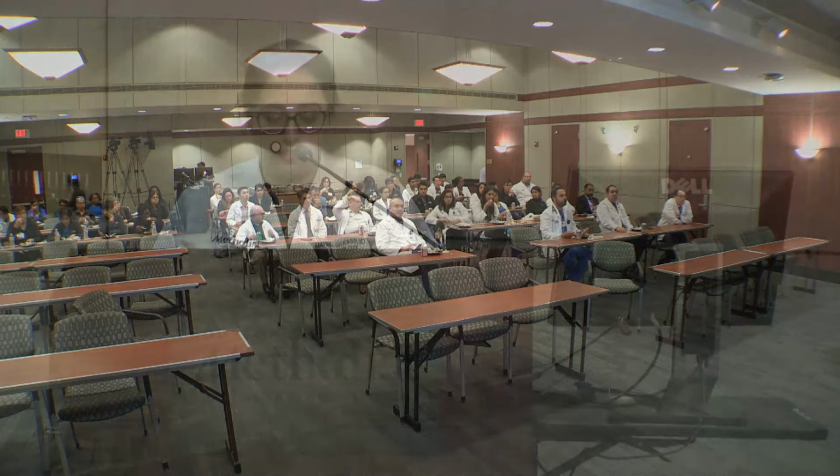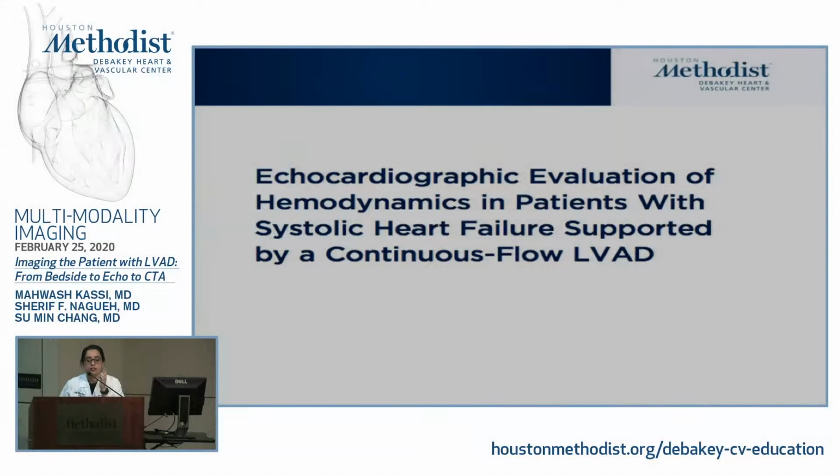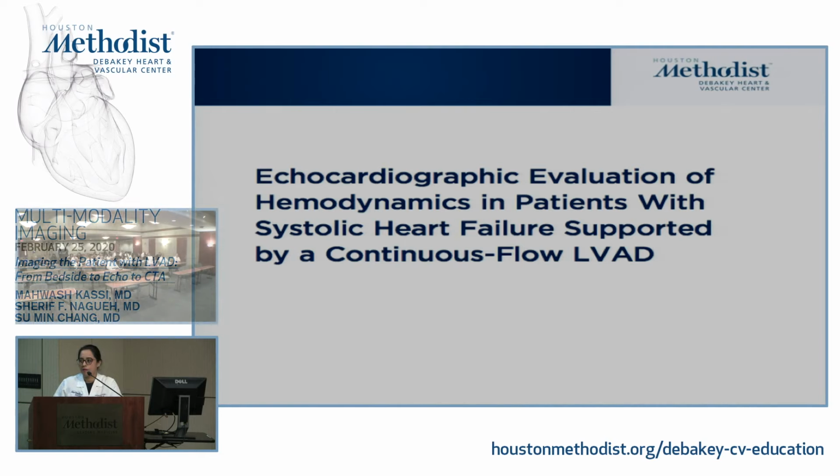And I'm going to tell you why I want to hear about it. I feel like in the last 1 year, since we have a lot of papers on 3D and volumes, we've had some insight into how the RV changes and the septum flattens, or the convexity or the concavity of the septum and the lateral wall changes. So that's important information. And I think in the future, if somebody rewrites the echo guidelines, these are important things that would need to be determined. But it's important since we have pre-established sentences, that we do not say pressure overload because there may not be a pressure overload. Right. So it's important that we just say septum flattening.